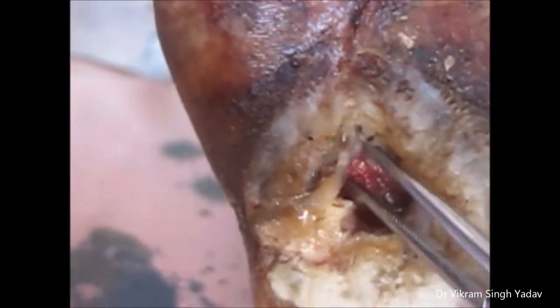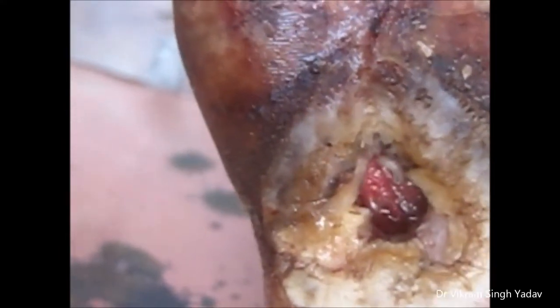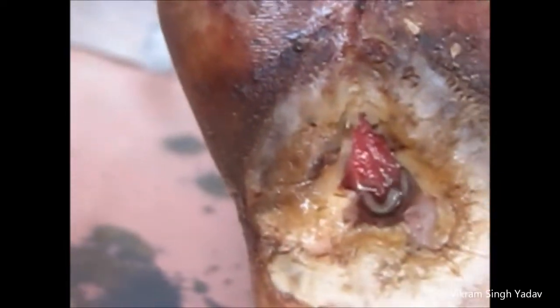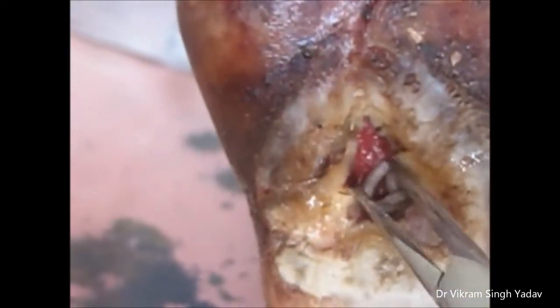When the wound size is very small, it becomes very difficult to pick them because they go further deep inside the wound. So in order to make it easy, you should make them unconscious by either using chloroform or something similar.